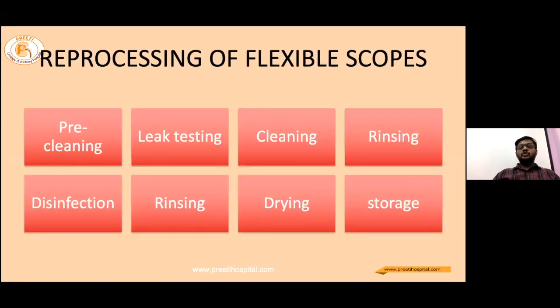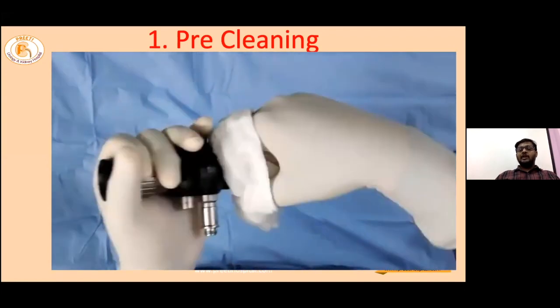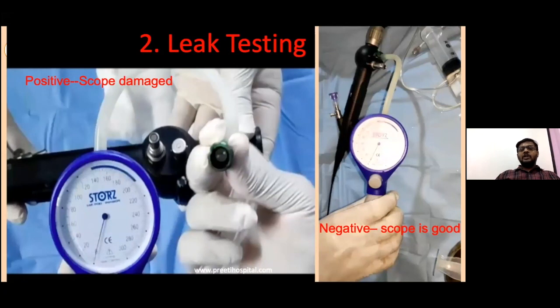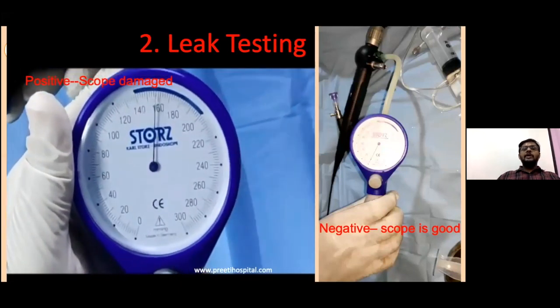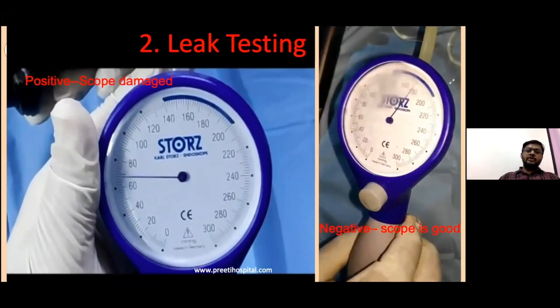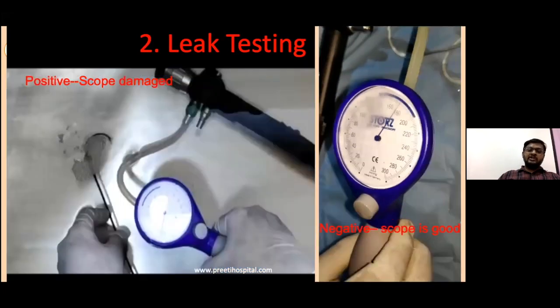The reprocessing of flexible scopes has been defined into eight different categories, and I will show you brief videos about each step. The first is pre-cleaning, which begins as soon as the scope comes out of the patient's body. The main aim is to make the scope less contaminated for further handling, using water or enzymatic solutions. After cleaning, we check whether the scope is leak-proof. In a leak test positive scenario, the scope cannot maintain pressure, indicating a leakage in the flexible channel — often due to laser fiber induced damage — and the scope goes directly to the manufacturer for repair.